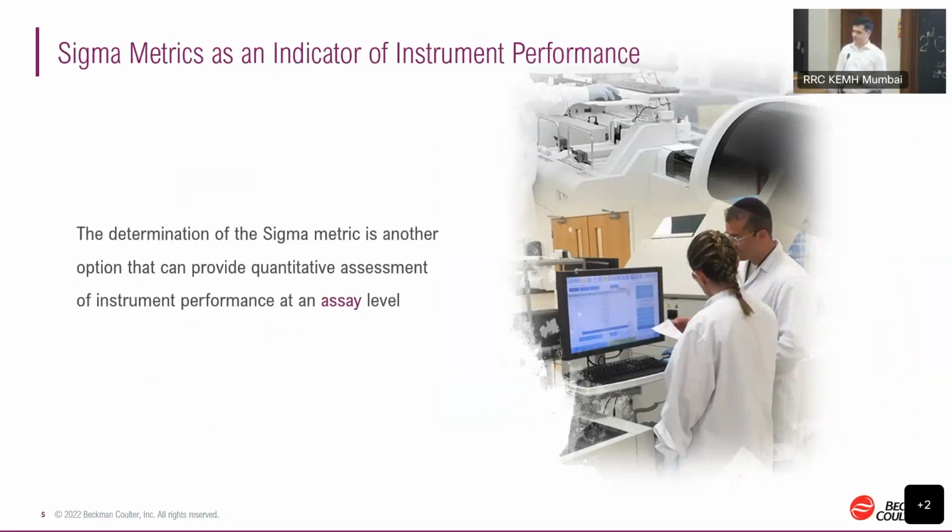Now, one of the requirements for Six Sigma is having to assess the performance of the instrument. So we'll see how we can assess that.